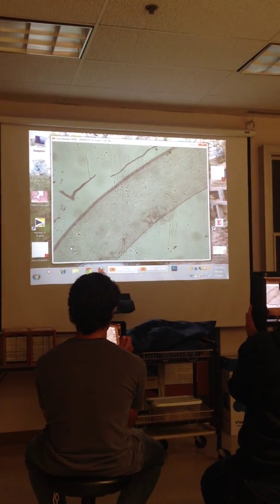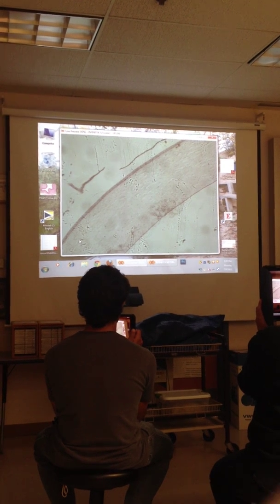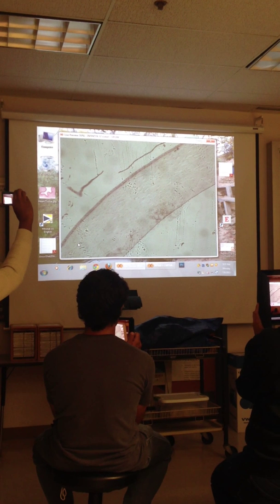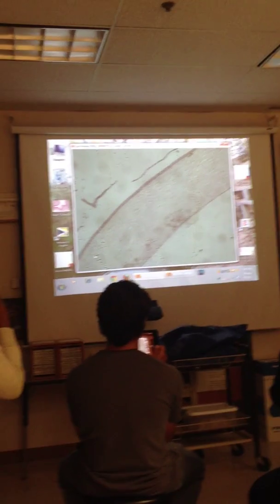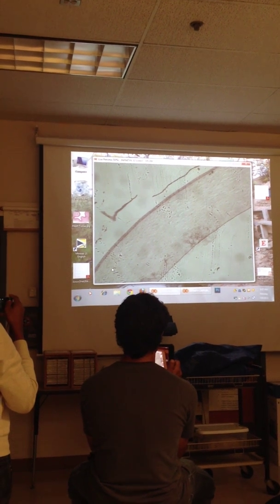This is one of those slides that's kind of better seen on your microscopes or on the complete picture. I have to go piece by piece here. Feel free to let me know if you don't need to be seeing that particular structure, because I have the general idea of what you need to see.